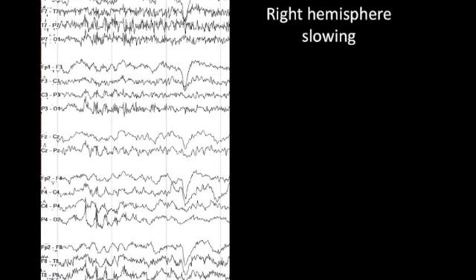We can also look at how different types of montages can look at a broad area of slowing in one hemisphere. In this example, I have included a short segment of a recording of a patient who just had a seizure arising in the right temporal region. It is difficult to see, but there is some polymorphic theta and delta activity in the right temporal region.